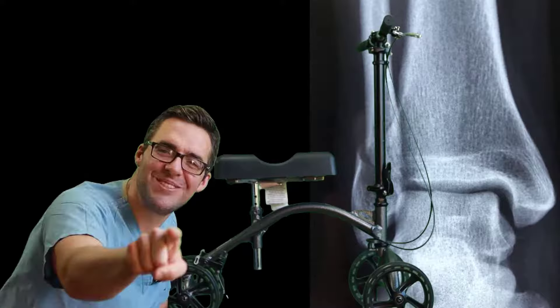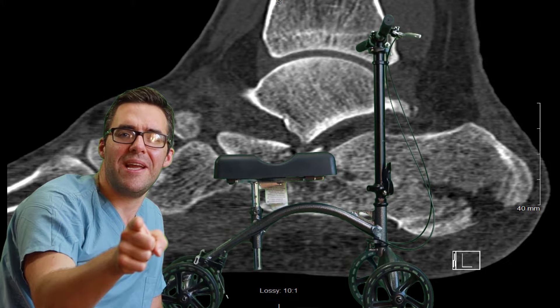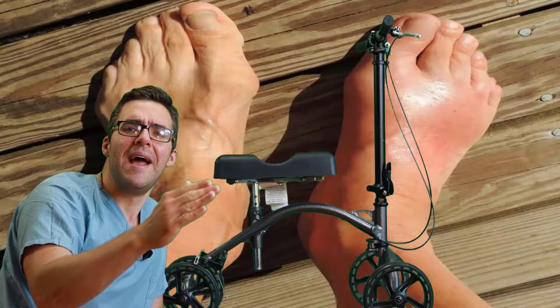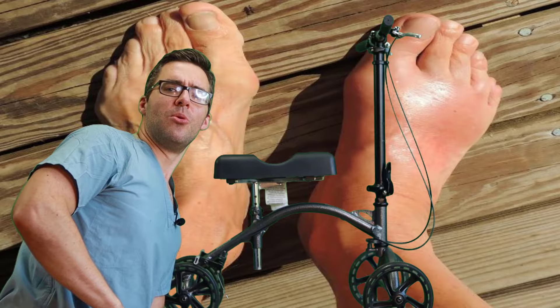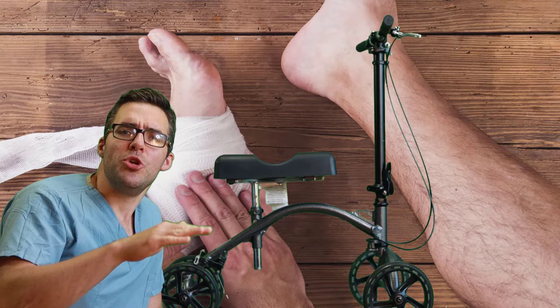Tip number one — see this right here. This is an adjustment to raise or lower the handle. You want to have the handle at belly level. Adjust that before you get going. Same thing with this seat right here — you want it so that your knee is at 90 degrees.